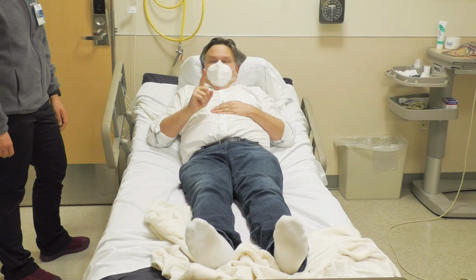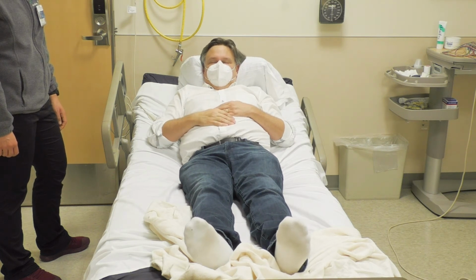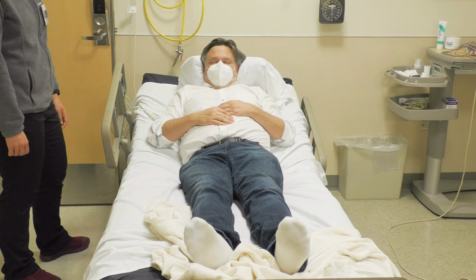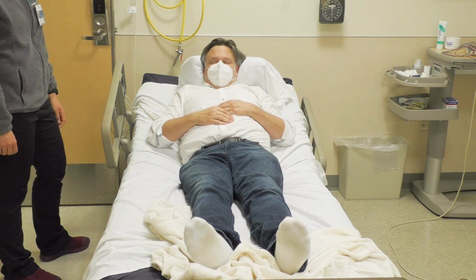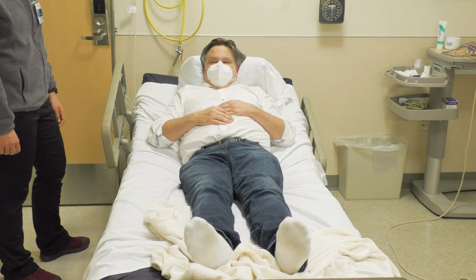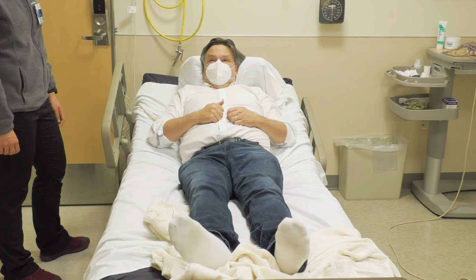So now I'm going to actually have what looks like a seizure. Observe and note level of consciousness, pupillary size, and any abnormal movements, behaviors, and describe these things out loud. Include any autonomic signs. Note the time when it seems the clinical seizure has stopped and the duration.